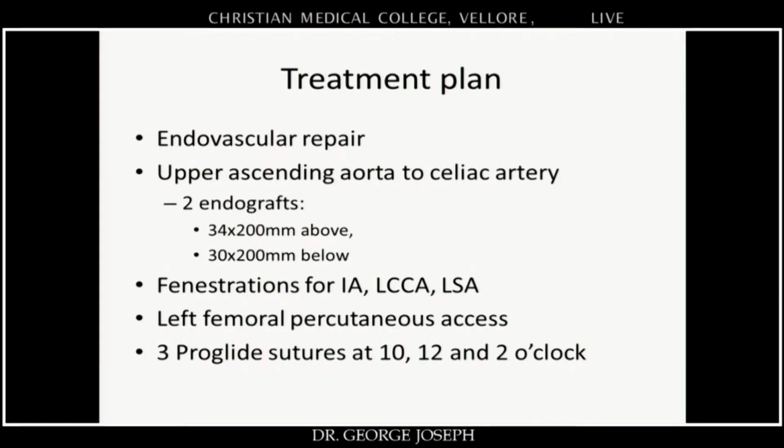So we also got left femoral 6F, left femoral venous 6F, and both radials 6F. Access is already in place, and also a carotid wire through a 4F dilator. So there's no sheath in the left carotid artery.